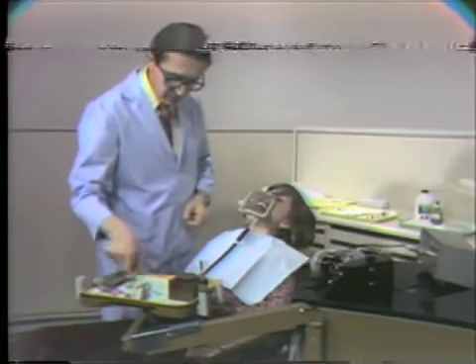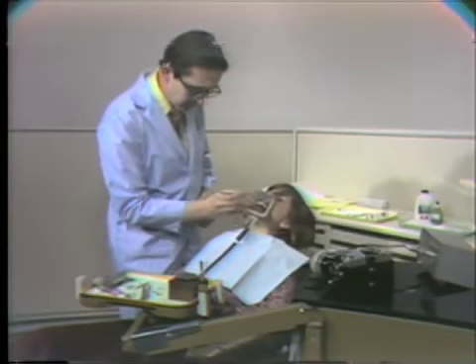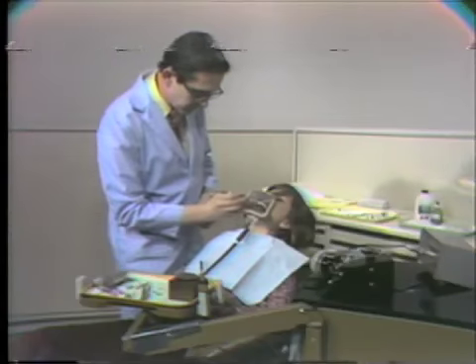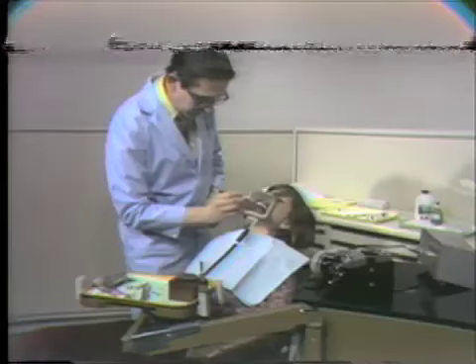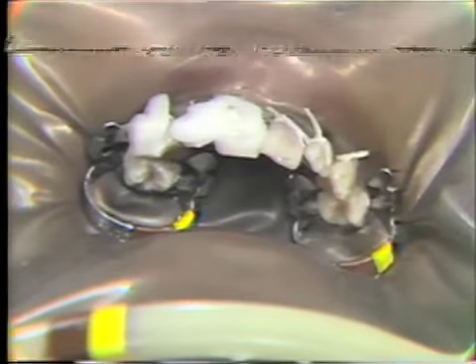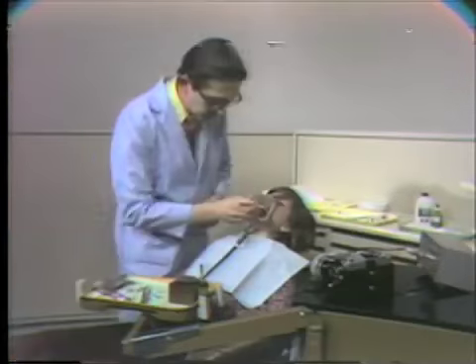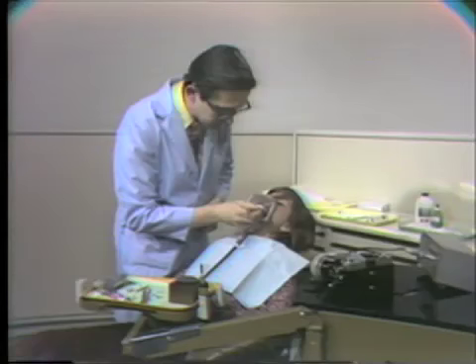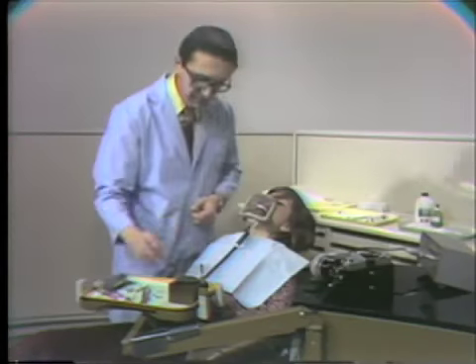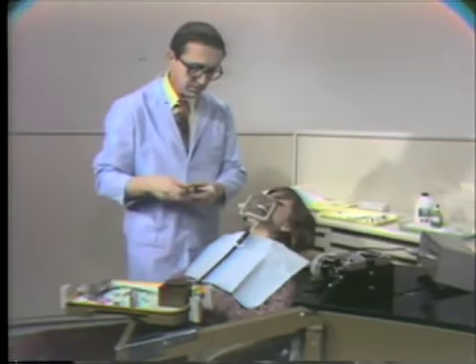When I'm putting the agent on your tooth, which I'll start doing now on the cotton, I'm going to be using a hot instrument on your tooth. And I'm going to be heating up each tooth. And if you feel the heat, you make some noise again, and I'll move to the next tooth. Now if you try and be real brave and put up with all the discomfort, we could actually heat up that tooth too hot and cause it to die. Understand that? Mm-hmm. Okay.